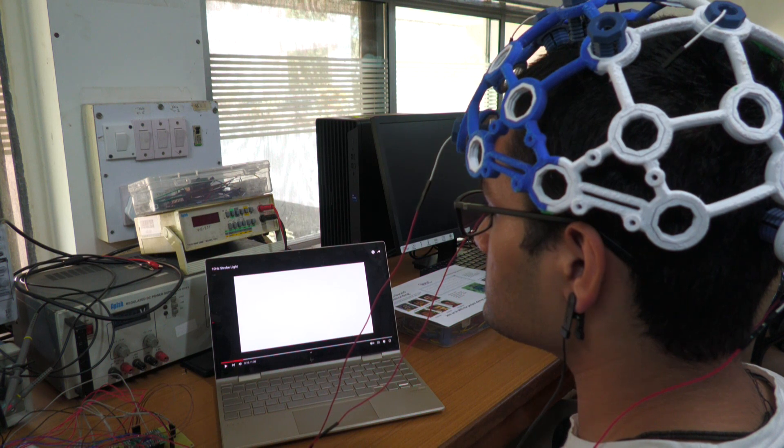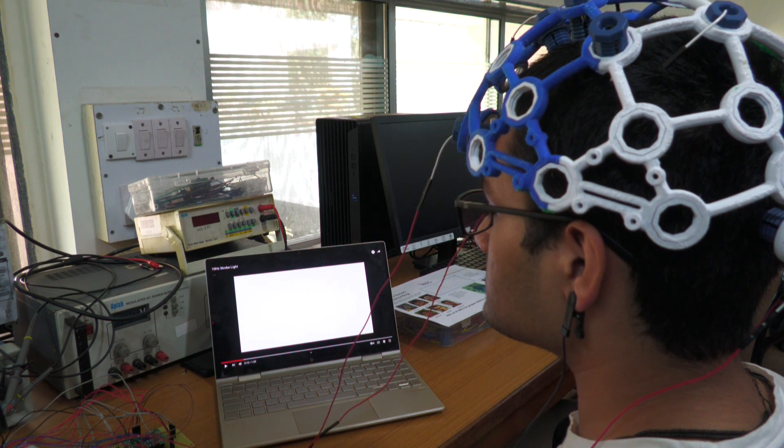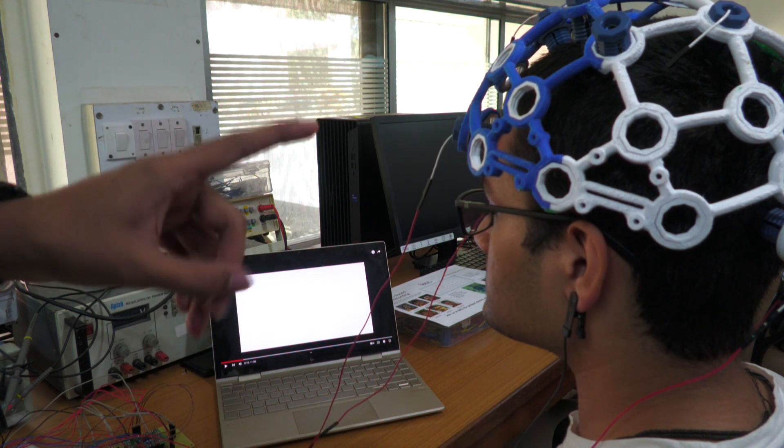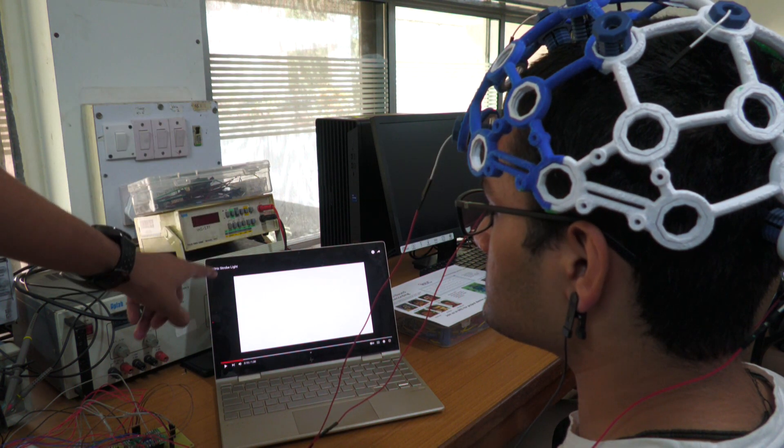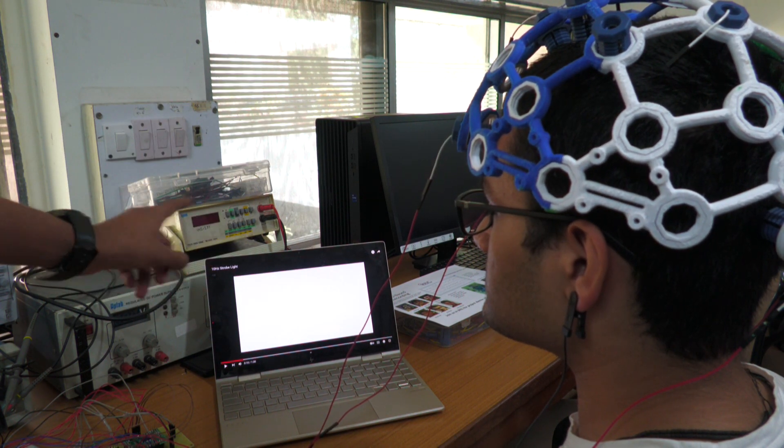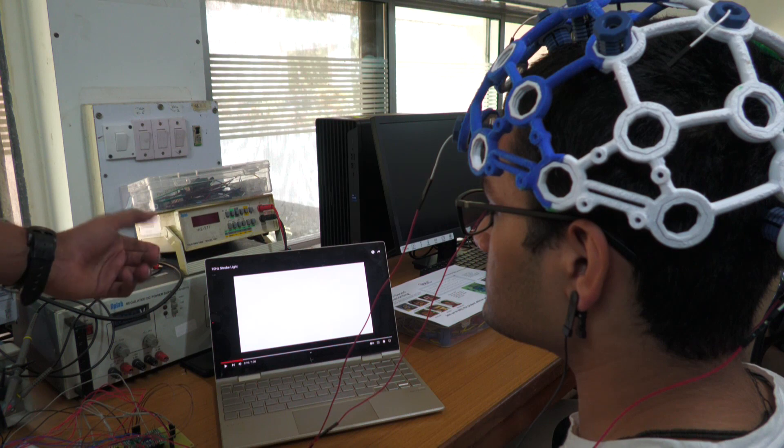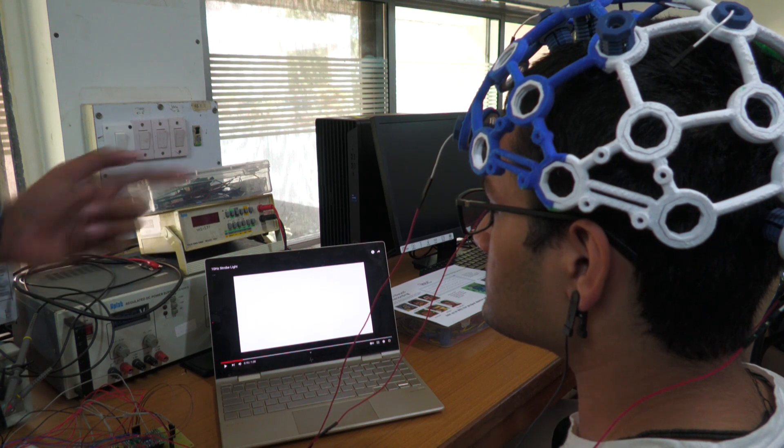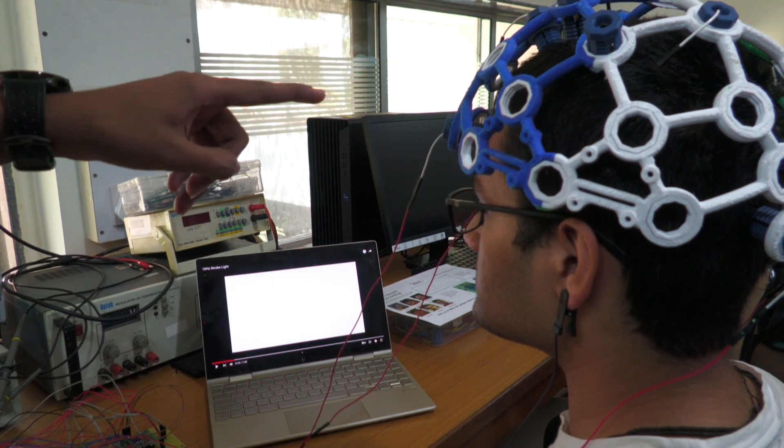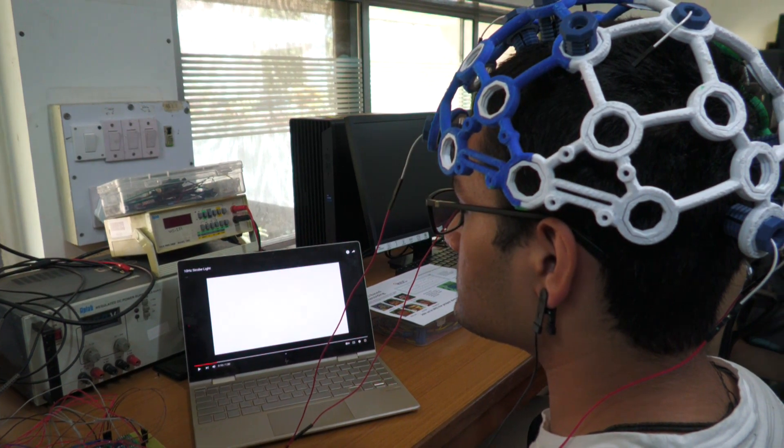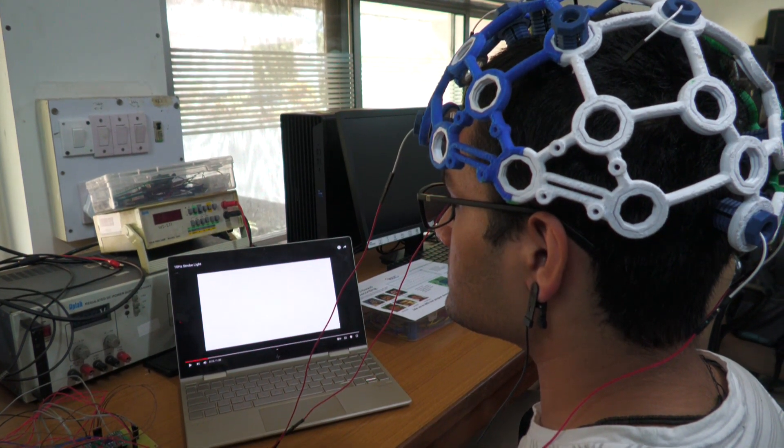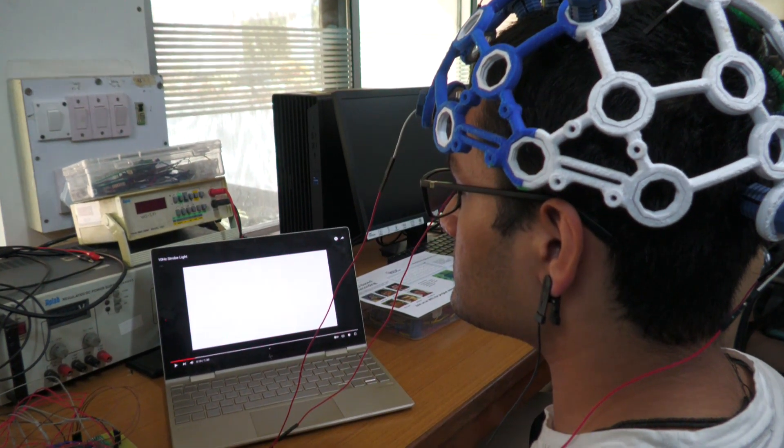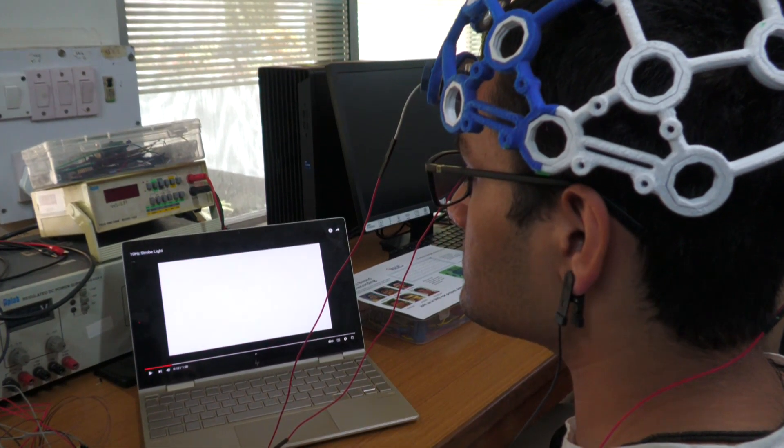So now we will be performing an experiment where the subject is exposed to strobe lights that operate at a frequency of 10 Hz. We will then acquire the signals from the electrodes and plot it using a software called EEGLAB which is meant for EEG purposes.